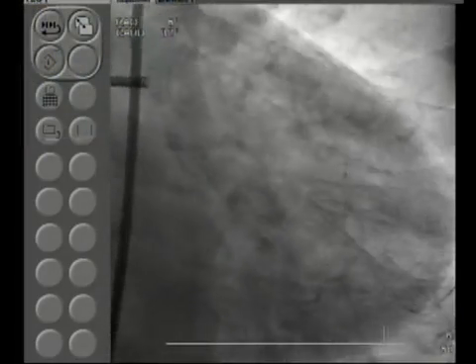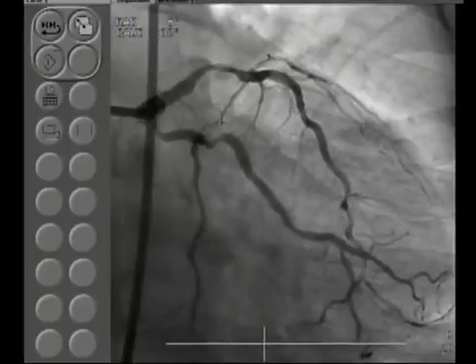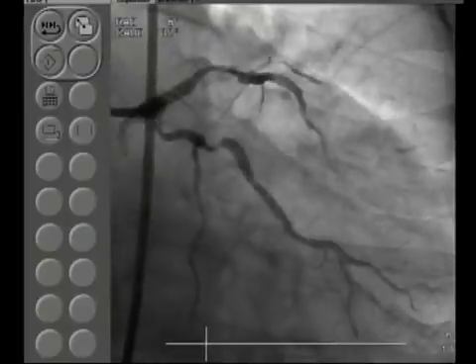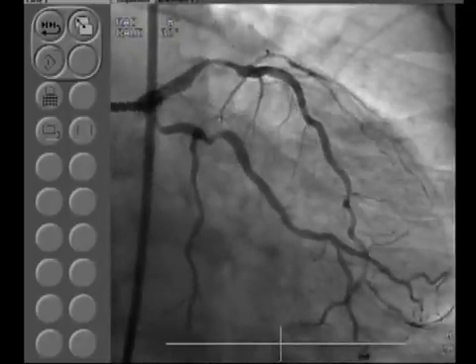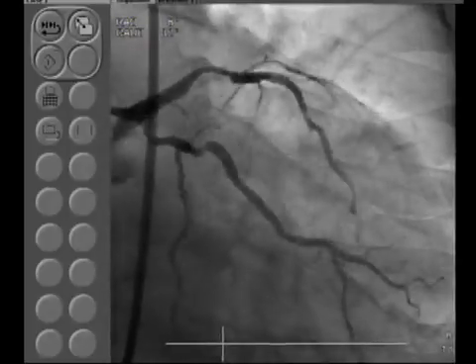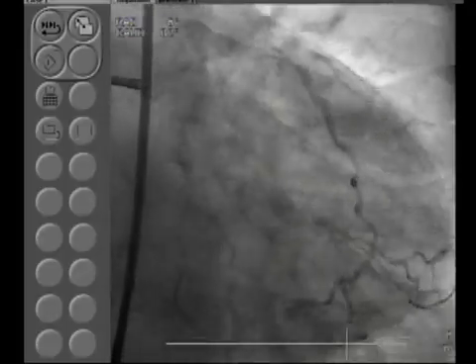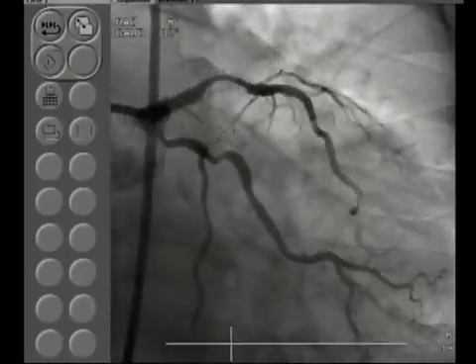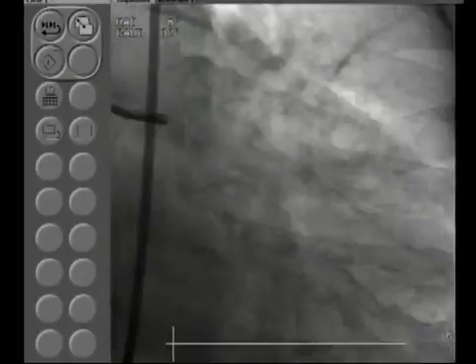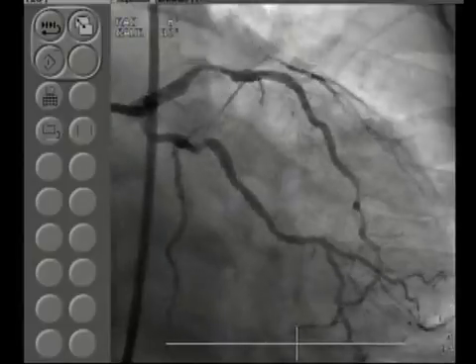Now this case is peculiar. Usually we keep very complex cases, but we felt that this is a real life issue: once you have such a calcific lesion, how to tackle it. You can see here, if the vessel size is 4 millimeter for the LAD, only the top about 0.5 or maybe 1 to 1.2 millimeter is the lumen. The remainder, 2.8, 2.9 millimeter, is a chunk of calcium. And this is a real question, how to tackle this calcific lesion. Knowing that many of our things have become quite simple, with a lot of emphasis on bifurcation and total occlusion, we wanted to put emphasis again on calcific lesion intervention.